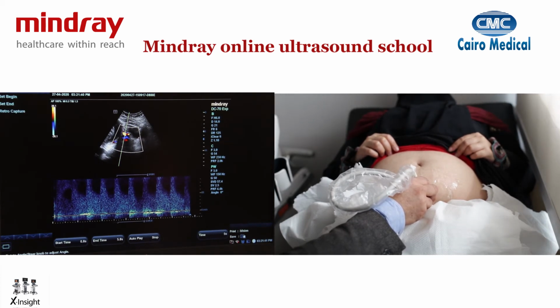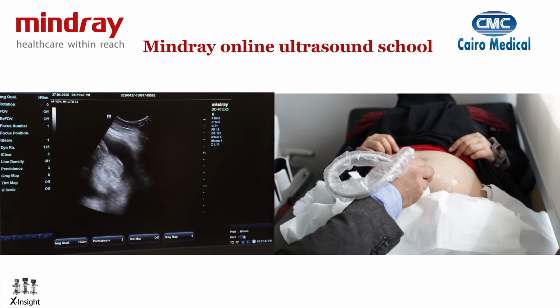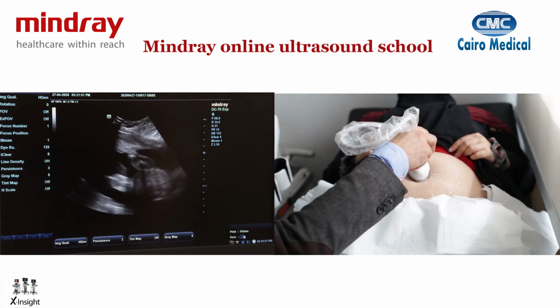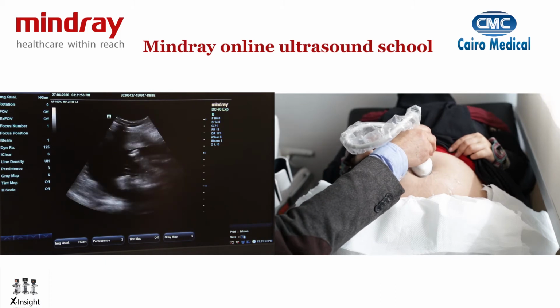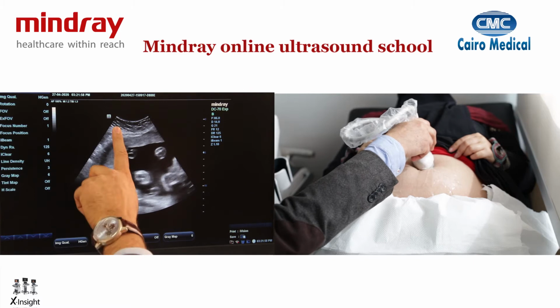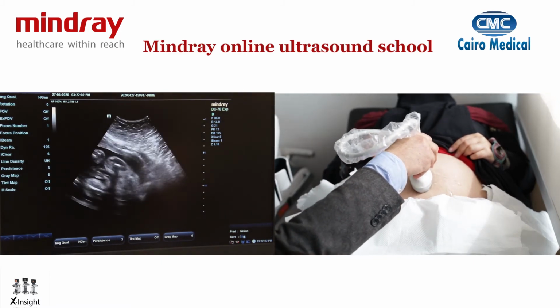And I can get another wave for the uterine vessels on that side, and I can measure. The next move is to actually move towards the baby, and I'm going to be moving the probe, still touching the patient abdomen at a 90 degrees angle, and I first of all will find where the placental location is. So as you can see here, it's a fundal placenta. I will divide the mother's abdomen into 4 quadrants.